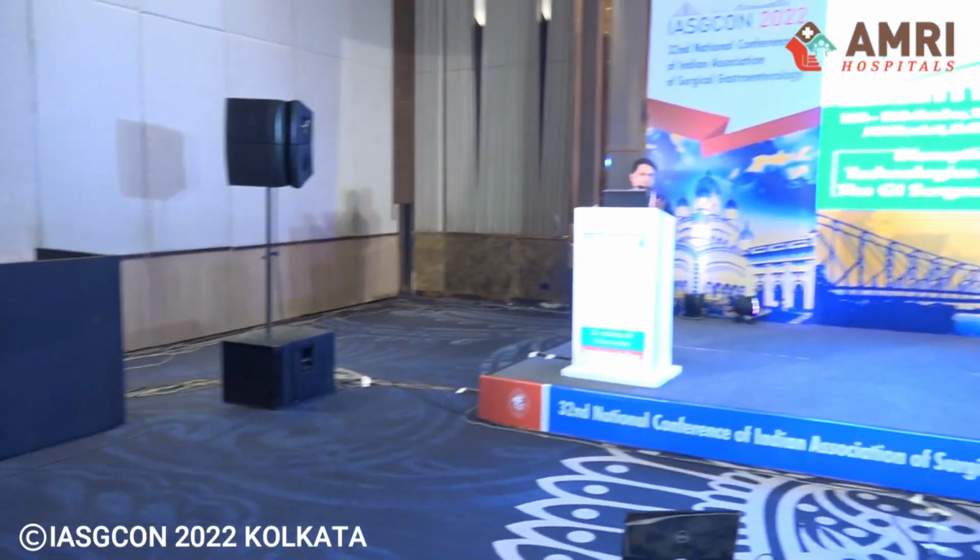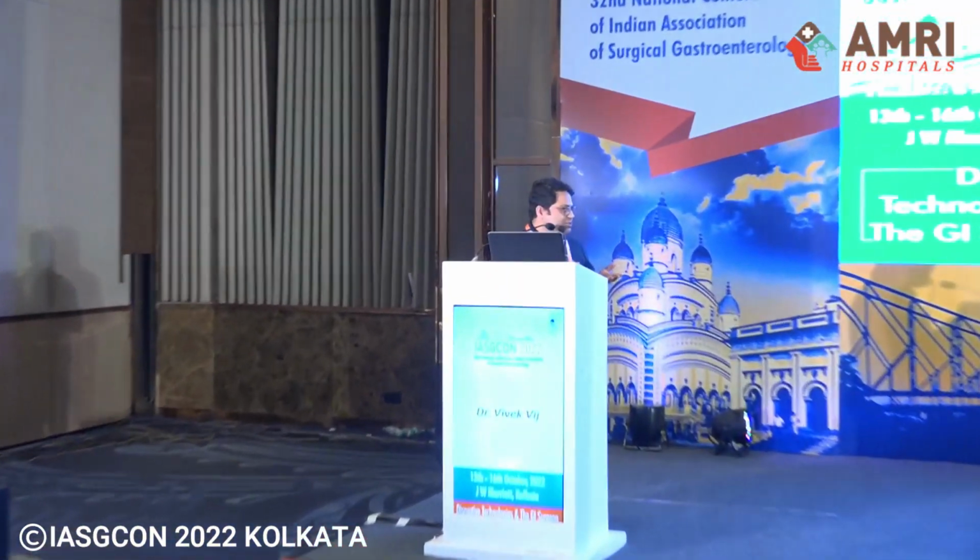Anything which can be done in laparoscopy can be very well done in robotics as well. I think robotic and lap are complementary techniques. The principles of liver surgery don't change, whether it is donor resection or CRLM or HCC. We have to follow the similar principles as for open surgery, and we have to learn driving these techniques. These are just cars. We learn to drive, that's it.